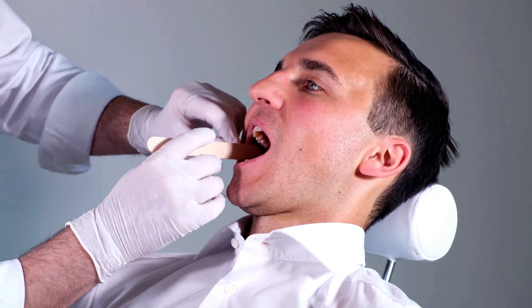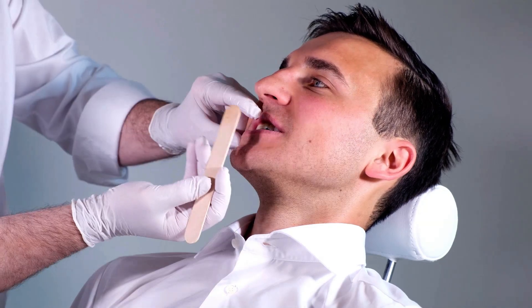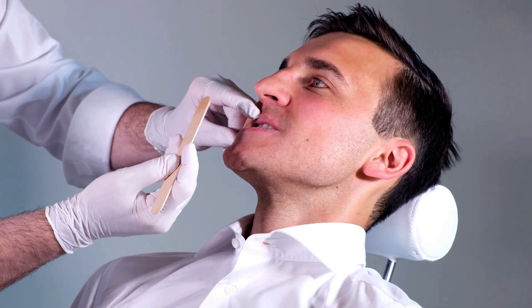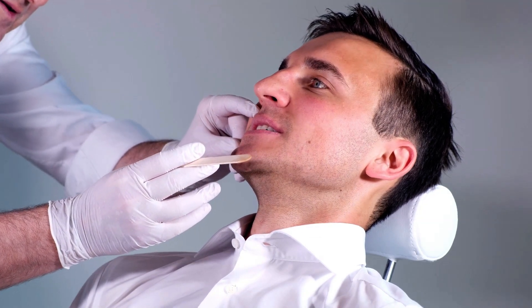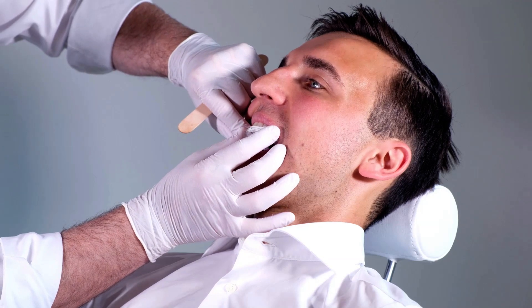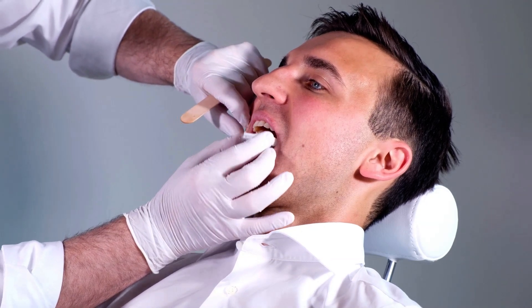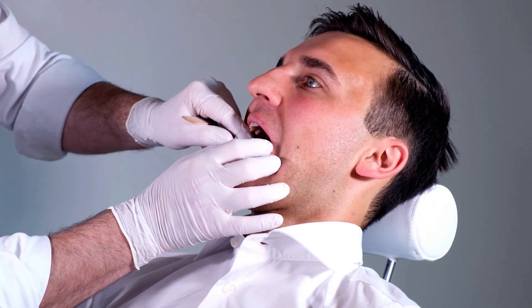Before fitting the appliance, check the patient's dental status and condition. You must also determine the mandibular advancement by letting the patient repeatedly move their lower jaw forward as far as possible. Also check whether the oral trays in their original form match the patient's dental arches. If not, the width of the trays can be altered after heating them in hot water.